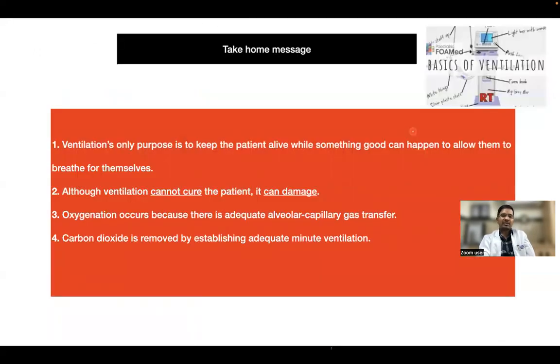Last but not least, we must always understand why we are ventilating. The important thing is that the only purpose of ventilation is to keep the patient alive while something good can happen to allow them to breathe for themselves. So ventilation is nothing but transitional support. If the disease is not improving, there is no value in mechanical ventilation. Ventilation might not cure the patients, but it can damage the lung.